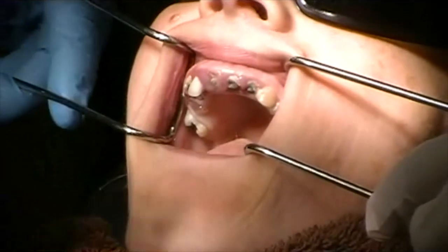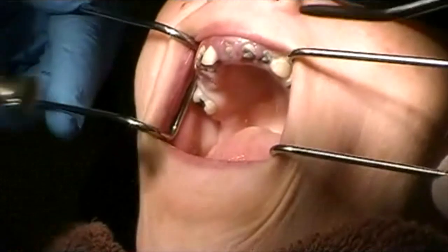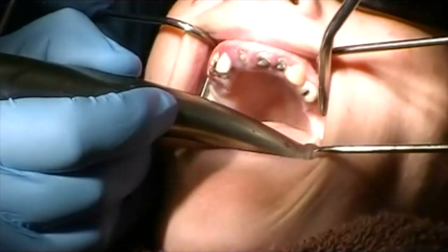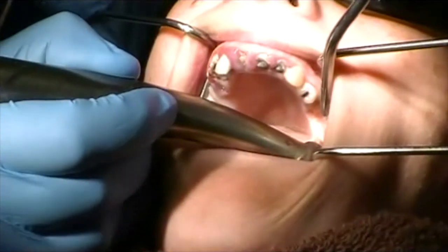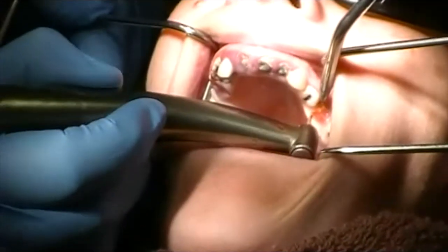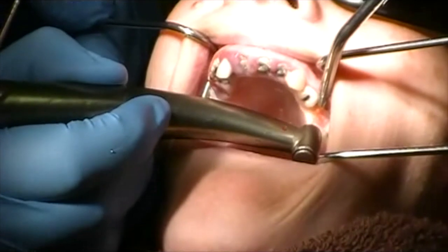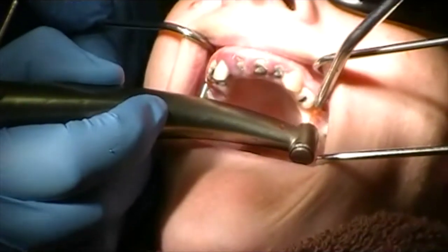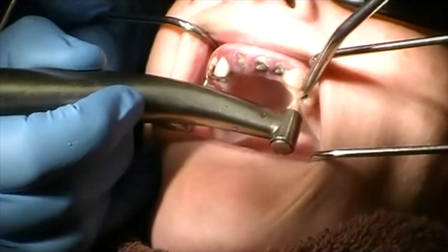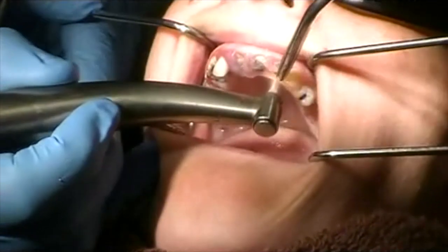I'm going about four to six millimeters subgingival. Here's a root that doesn't have a lot of coronal portion to it, and I'm simply creating a little purchase point on each of these.